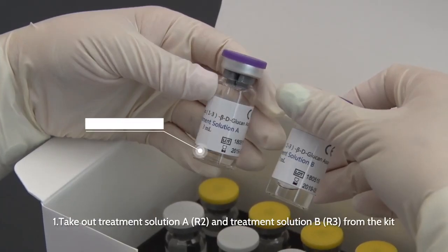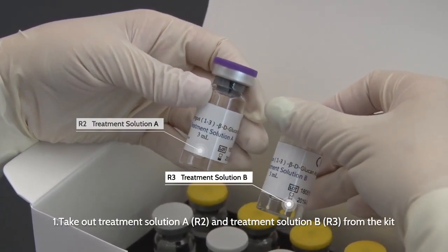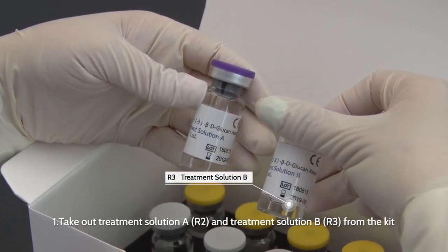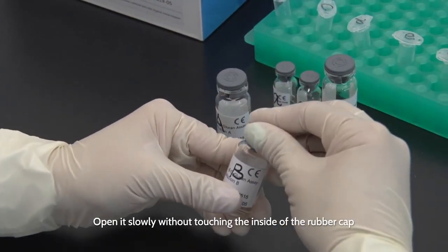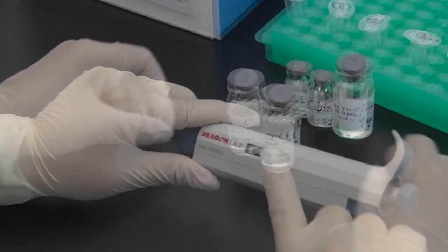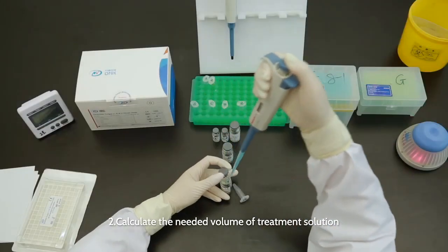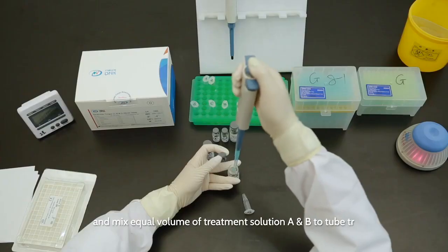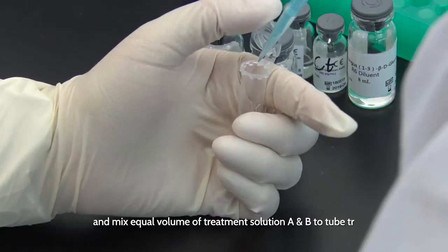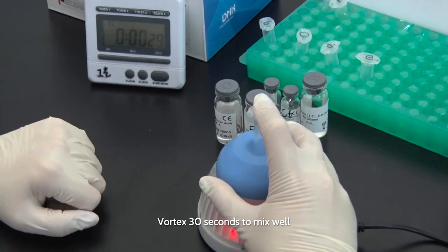1. Take out treatment solution A, R2, and treatment solution B, R3, from the kit. Open it slowly without touching the inside of the rubber cap. 2. Calculate the needed volume of treatment solution and mix equal volumes of treatment solution A and B in tube TR. Vortex 30 seconds to mix.